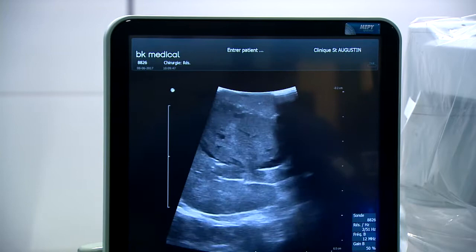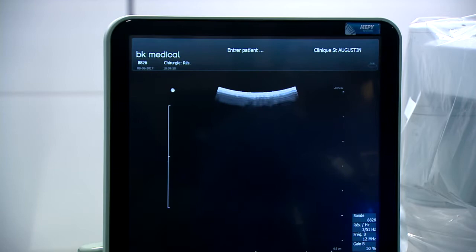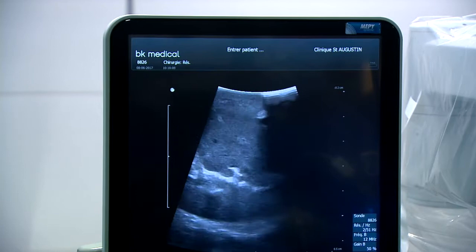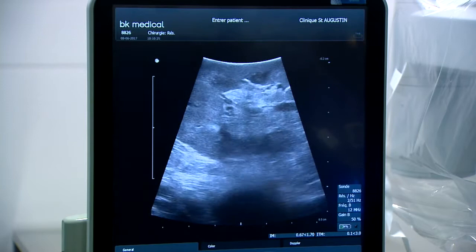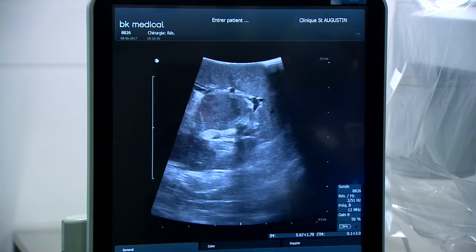So we are now going to start scoring. Okay, so this is tumor, and that's where it finishes. Ultrasound, that's the tumor. I'm scoring, I'm trying to get it here. So that's where the tumor goes away, right? So tumor, no tumor. Okay, I'm scoring it, and again, that is the tumor now. Now we're going to the other side. Tumor, no tumor.